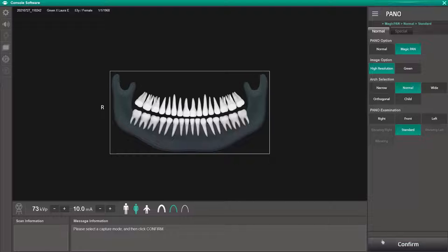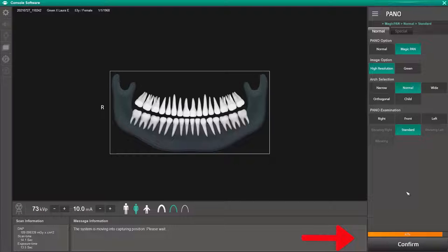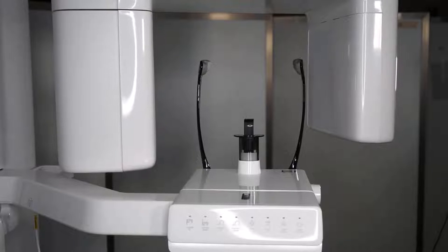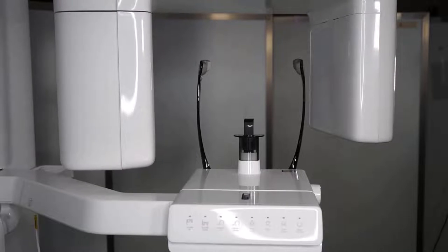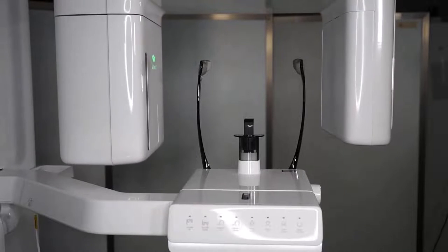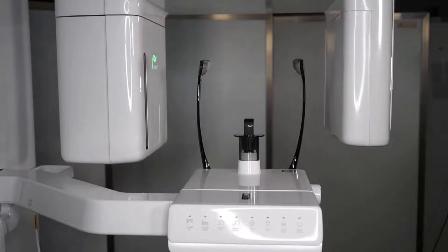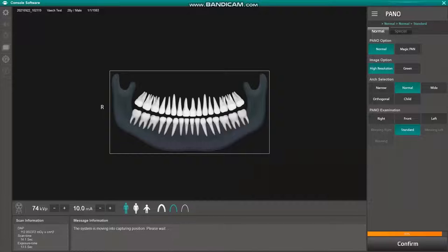Once our selections are made we can simply click confirm. The next step is to allow the machine to rotate to the acquire position, and then we can position our patient.